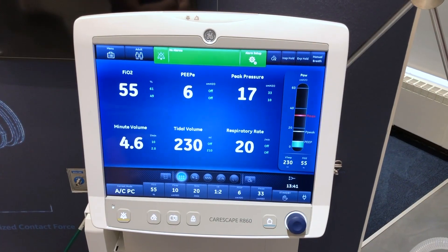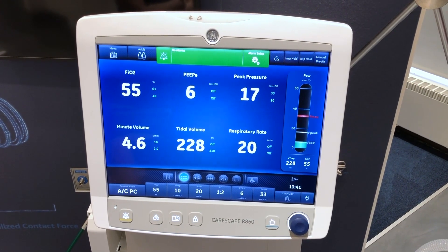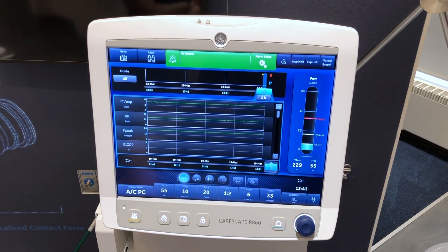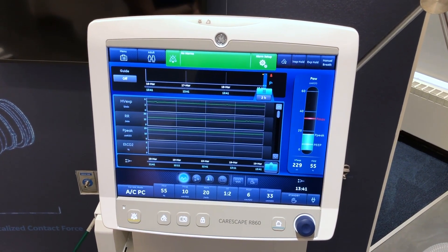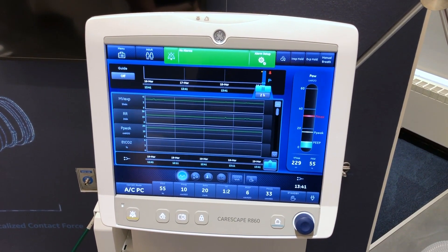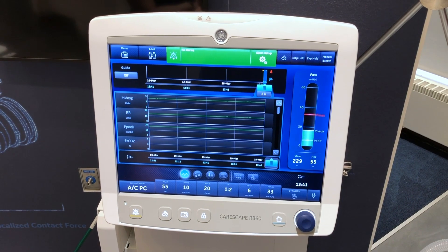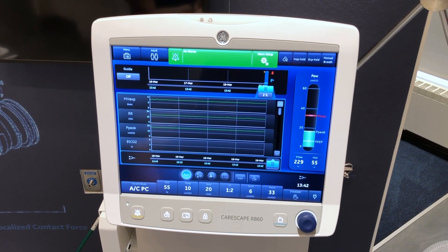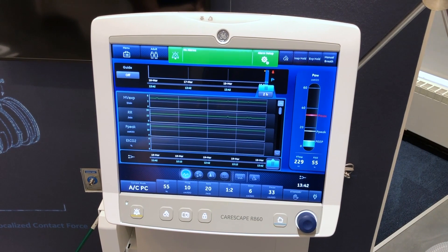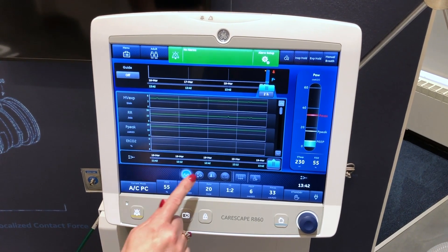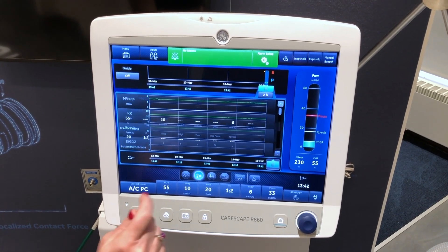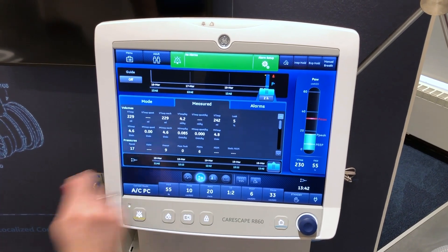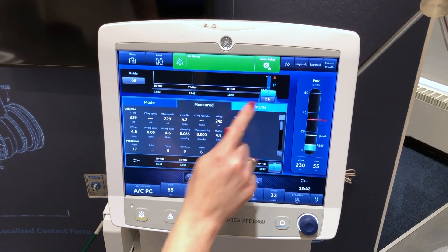To review patient trends, touch the icon to display the historical trends workspace. Select the historical trends workspace for access to graphical trends view to review historical waveforms and patient trends. Numerical trends view to review patient ventilation modes and settings, and measured data.